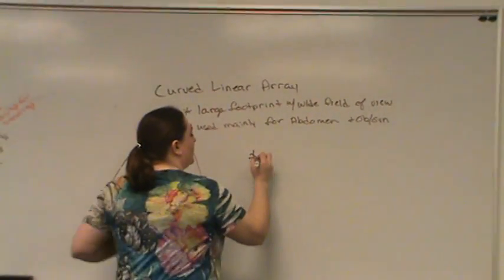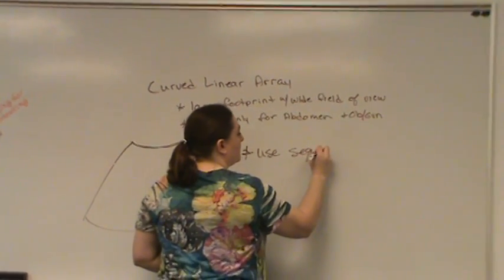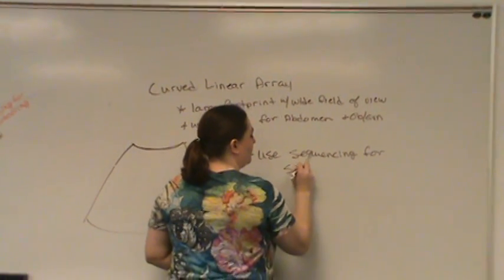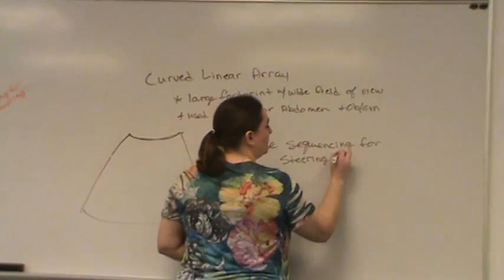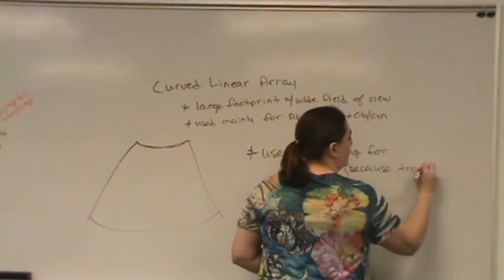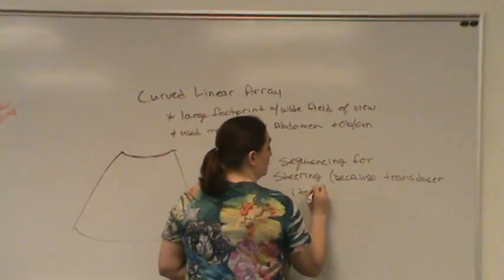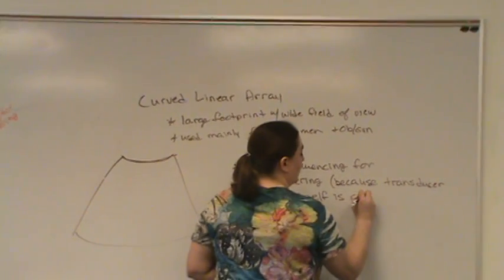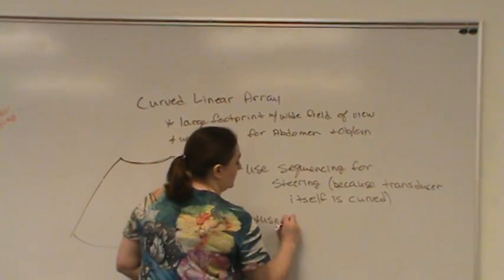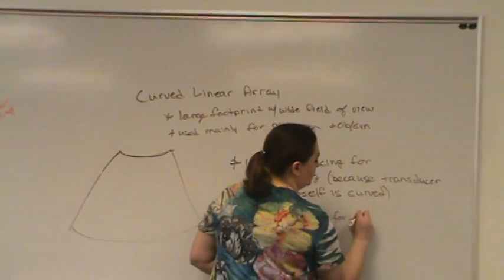So this one, like this linear, is going to use sequencing for steering, and then use phasing for focusing.